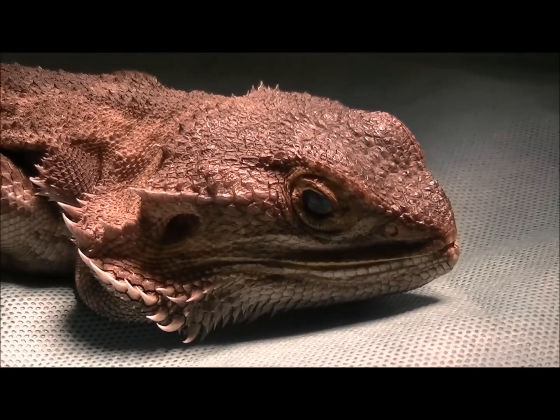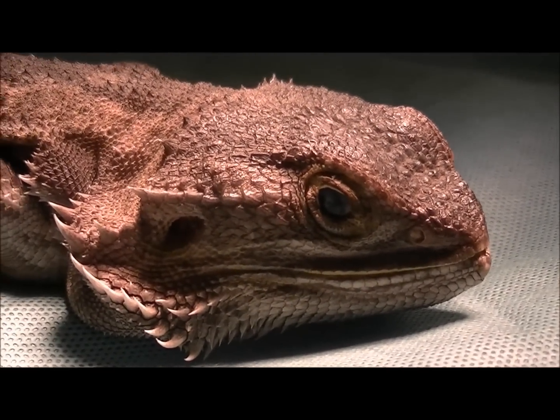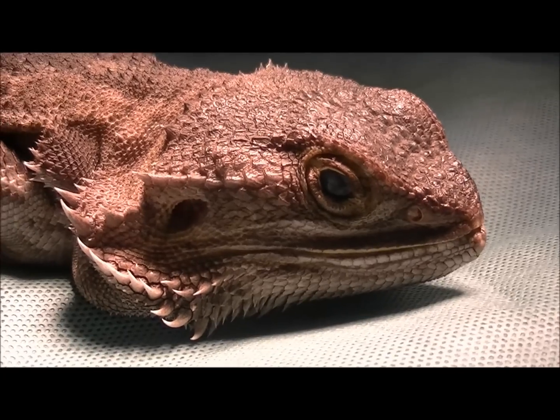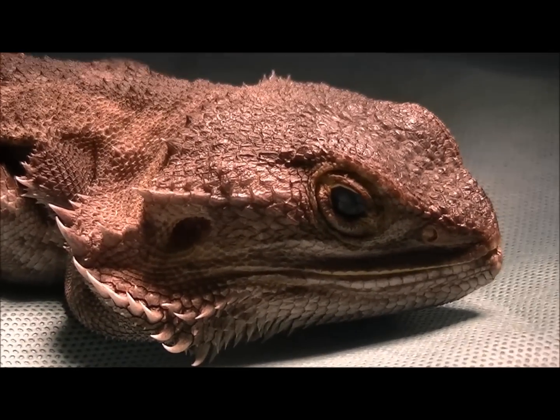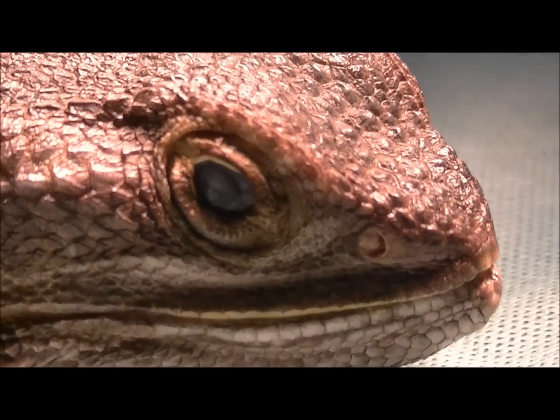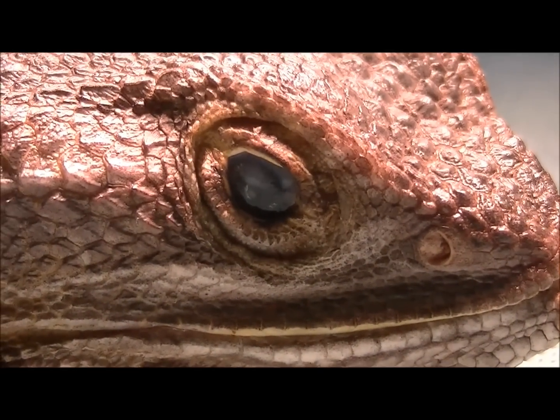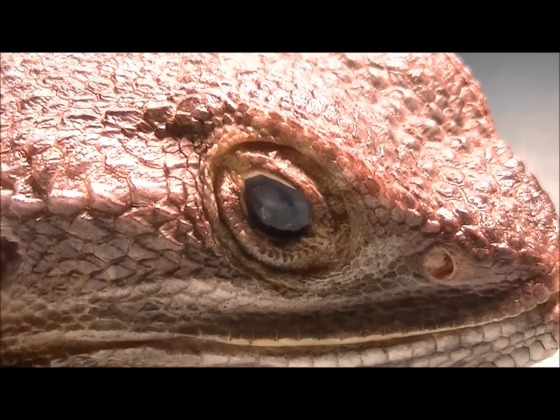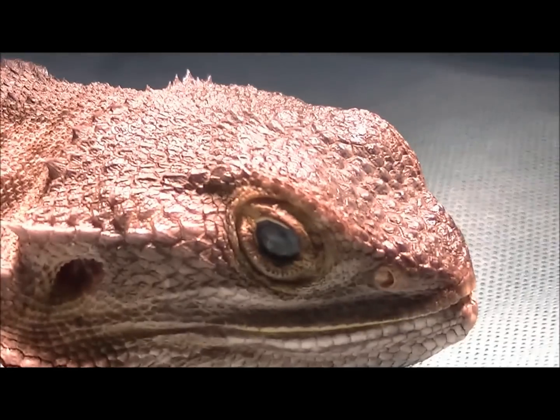Hi everyone, Shane from The Reptile Doctor, and this is Jack. Jack is actually a female bearded dragon and Jack's about to go to surgery. You can see there that Jack's right eye doesn't look 100% normal — there's some white scarring tissue and the whole eye doesn't look too healthy, but that's actually not Jack's problem.